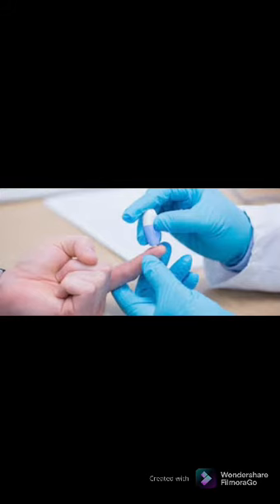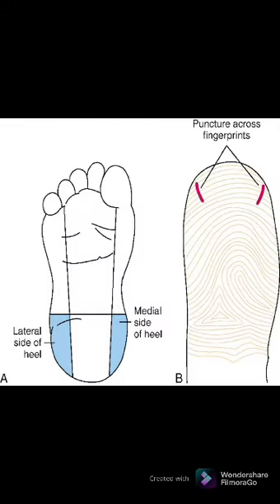Then puncture site and discard the lancet. Wipe away the first drop of blood, then fill and mix tubes in order of draw. Place gauze and apply pressure. Label specimen and observe special handling instructions. Check the site to see if it stopped bleeding and apply a bandage.